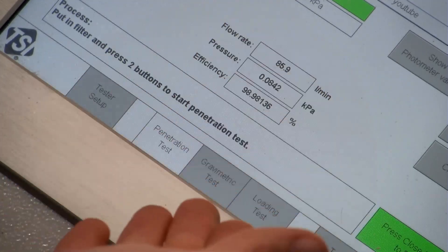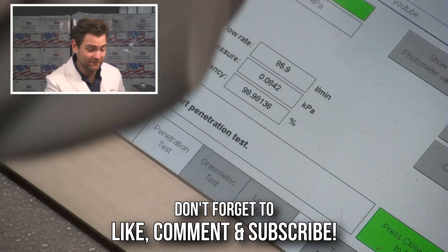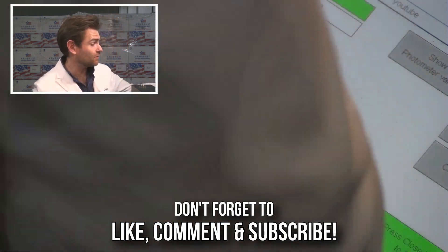Does that show in the test here? 98.98 percent. 84.2 pascals. That's a great mask.